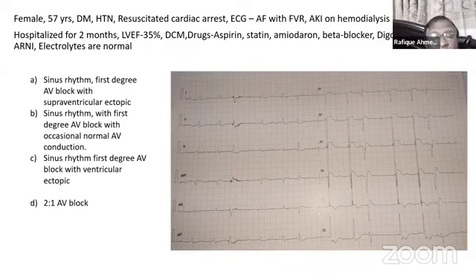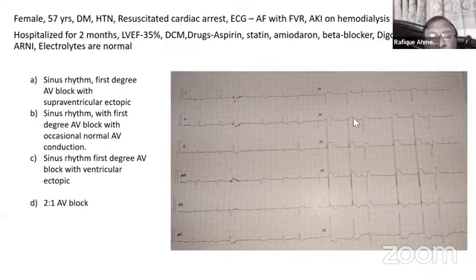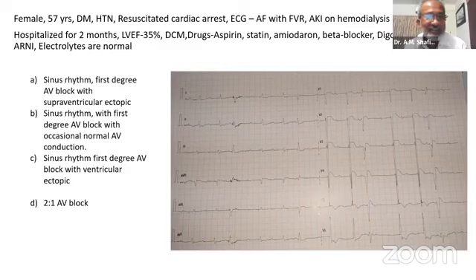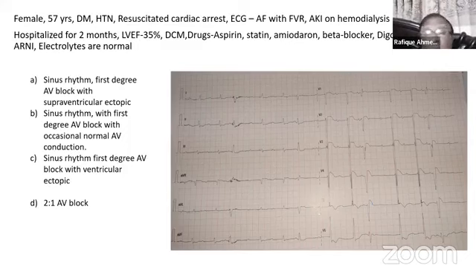Okay, but if you look at the P wave, for this QRS complex that we are considering a PVC, there is a P wave before each of them, with the same interval. That would be a big coincidence. So I'm sure if I had this ECG and measured it, I would find that the PR interval is constant in all these beats. That makes me think there is a relation between these two. How can I explain it? Because the initial RR is longer, and then it conducts aberrantly.